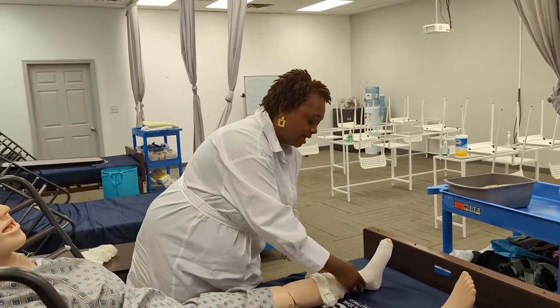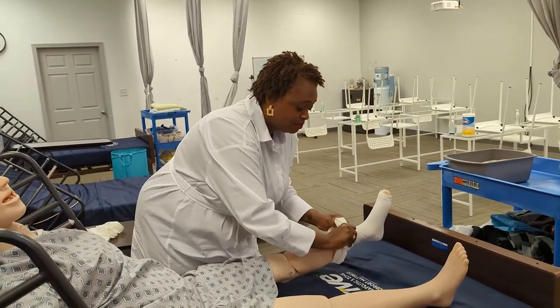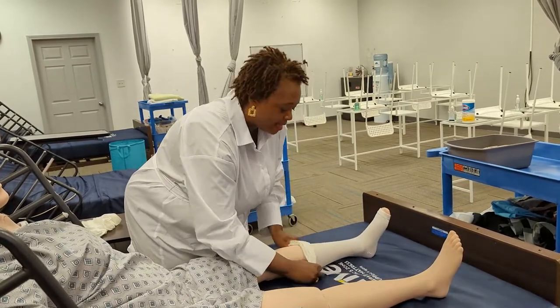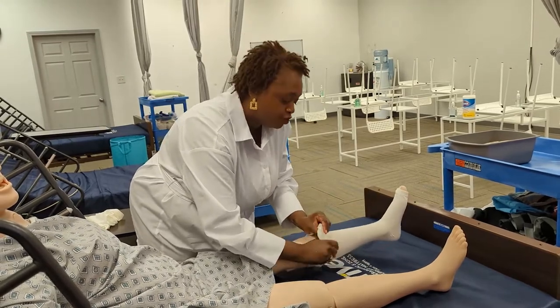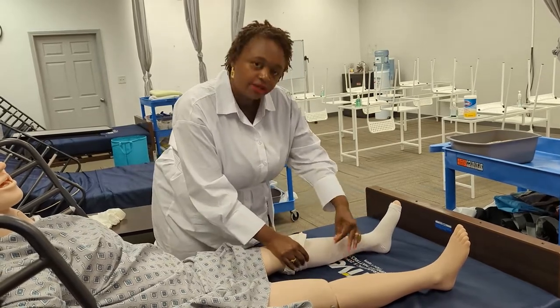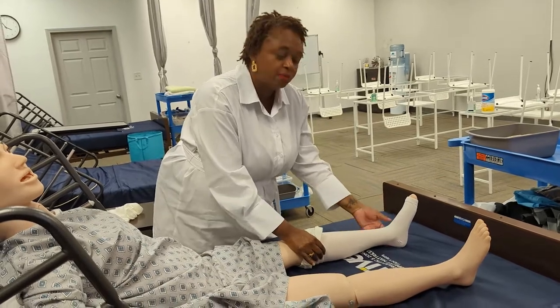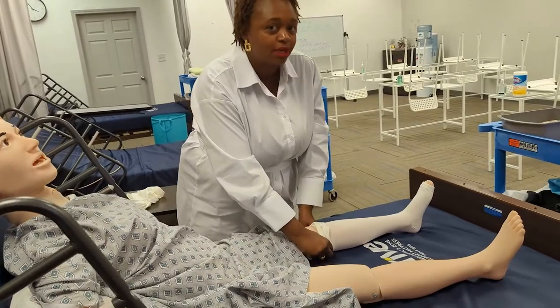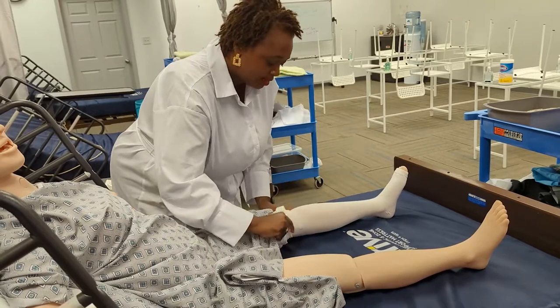Once you get the heel set, start smoothing. Be careful with your nails — you might inadvertently push the patient's skin. It's kind of a roll-up-and-smooth-as-you-go technique. If you roll it all the way up and find wrinkles, you'll end up pinching the patient's skin trying to fix it. So once I get it on, I roll up and smooth as I go along — and you can see it's even difficult on a mannequin; imagine a real person.